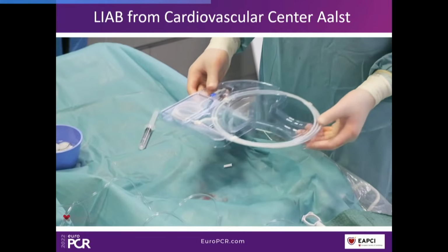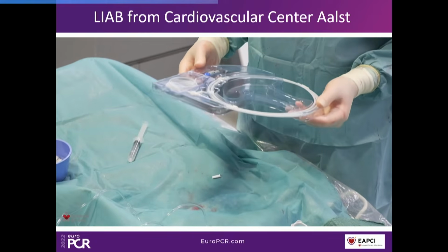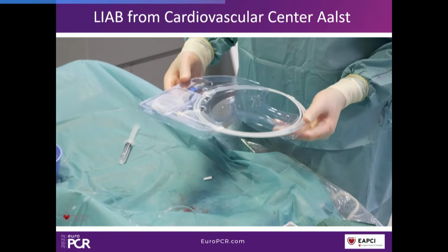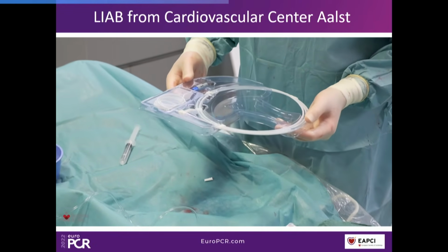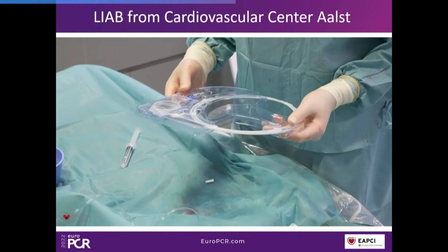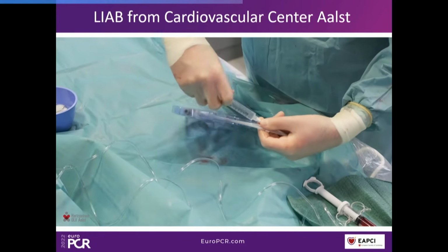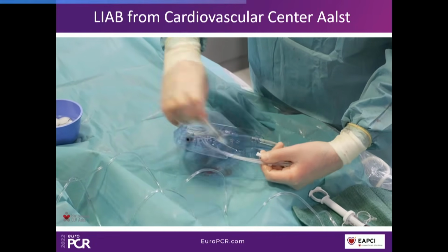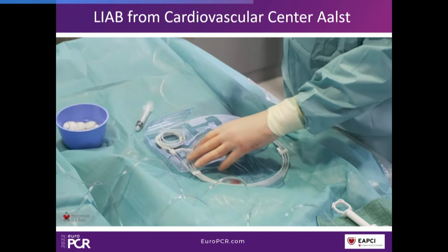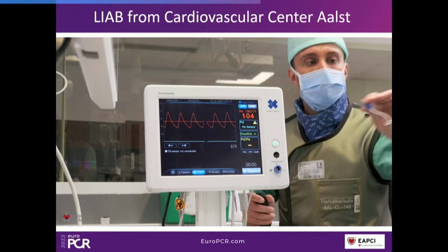Good. Okay, so we'll start with the preparation of the TruePhysio catheter. This is the over-the-wire rapid exchange catheter that is very useful in multi-vessel evaluation of FFR. And I will show you how we prepare the catheter and how we connect it to the Vivo Cardio station. So we flush the catheter. Once flushed, we will open it and attach it to the Vivo Cardio console. Please.